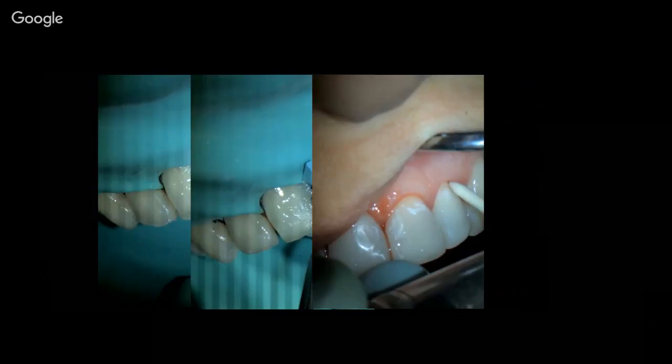And when we do composite restoration, or even when we bond a veneer or a crown, basically everything, we need to be very, very sure that the soft tissue is very clean. It's mandatory. We need a healthy periodontium to support our beautiful teeth. Otherwise, we are wasting our time and we are not taking care of our patient's health.